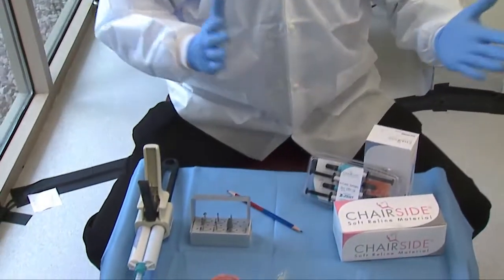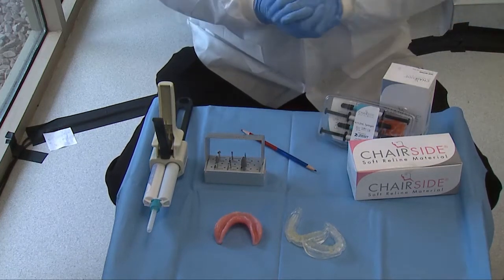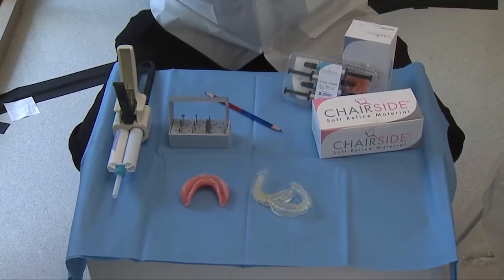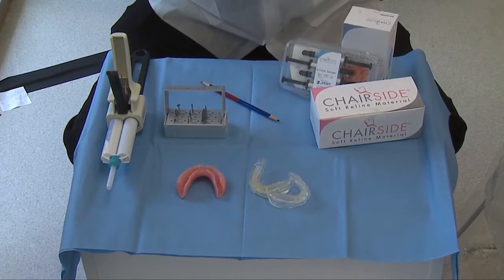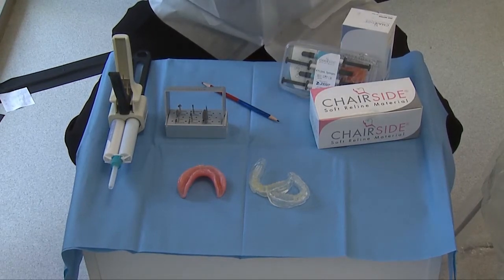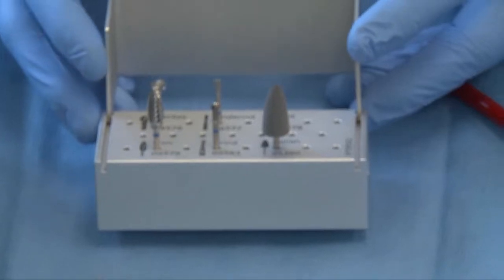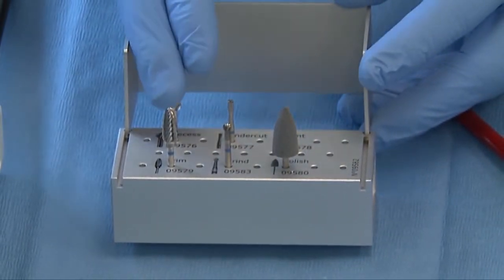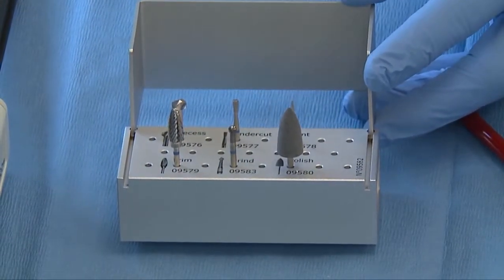We're going to be demonstrating all of the materials that we have to do our chair side soft liner. Ideally, we could choose the option right now. We have four implants that have torqued in above 30 Newton centimeters, so we could do the denture pickup in her mouth. However, with that soft tissue healing and the incisional line, our decision today is to go ahead and do a soft liner.